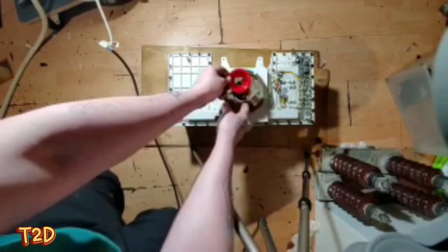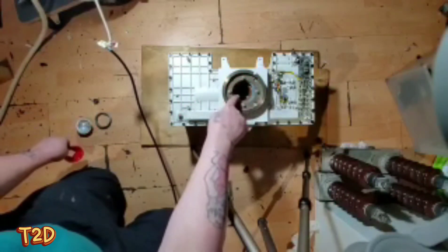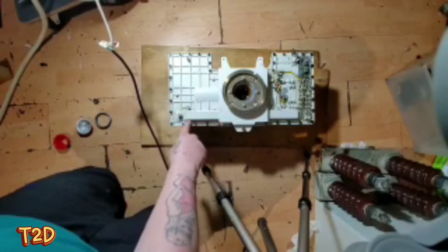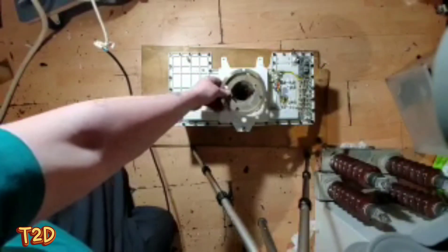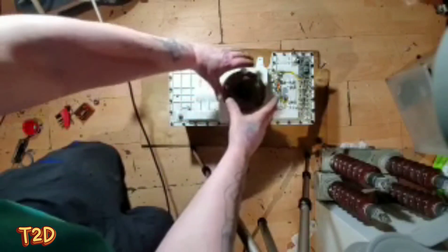Then we've got some beam-shaping stuff - this is another lead insert, obviously just to shape the beam as it comes through the aperture. After that we've got the aperture itself, and inside is the x-ray tube. This is oil-filled, so we'll get these Allen bolts out and take a look inside.